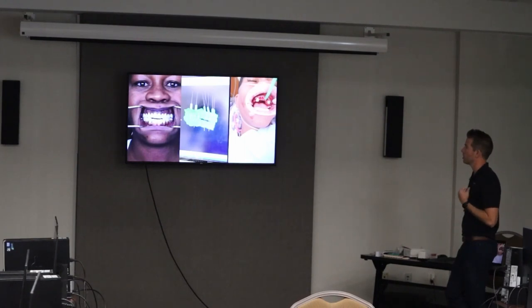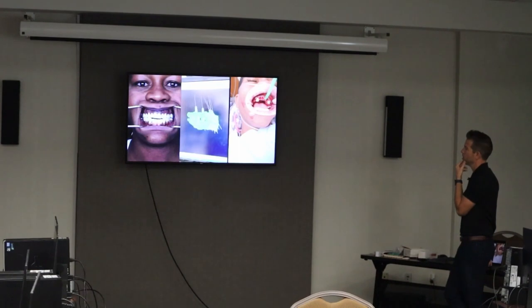Let's finish up here — this is Latoya's case that we're going to do. We talked about the positioning of her teeth. The case plan involved canines and second molars.